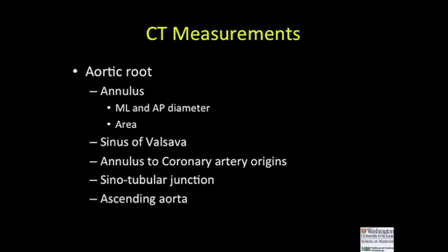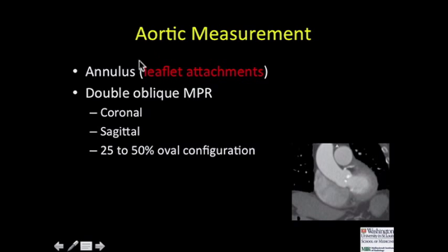The measurements that help our cardiology colleagues — first and foremost, we spend a fair amount of time looking at the aortic annulus, doing a medial-to-lateral and AP diameter as well as area of the annulus, measuring the sinus of Valsalva. They really need to know the distance from the annulus to the coronary artery origins for device positioning, as well as looking at the aortic configuration. If it's very tortuous or dilated, they may not be able to navigate from a femoral approach.